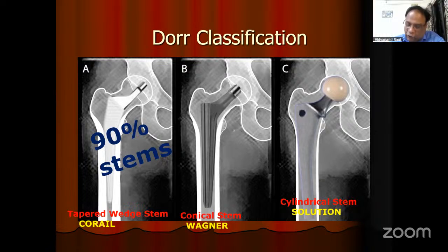Again, we should use an uncemented cup if it is fitting there. Only if we find that we are not achieving fixation or stability with our trials, then instead of opening the uncemented cup and wasting it, and finding at the last moment that the cup is not working, we can go for the cemented cup. But with proper technique, 99% of the time you can predictably insert an uncemented cup, even in osteoporotic bone, even in rheumatoids, even in ankylosing spondylitis.